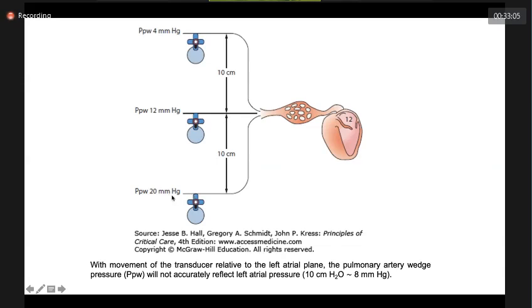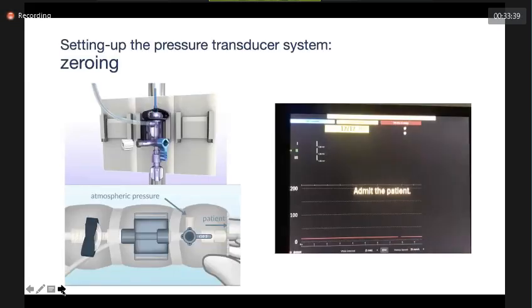Your pulmonary capillary pressure is going to be erroneously, significantly high, giving artifact here, around 20 millimeters of mercury. Whereas in a neonate or an infant, if you are not keeping it properly, when you are doing any cath work, your capillary wedge pressure is going to be low. So that is the reason you need to have a properly placed transducer system which corresponds to the phlebostatic axis.